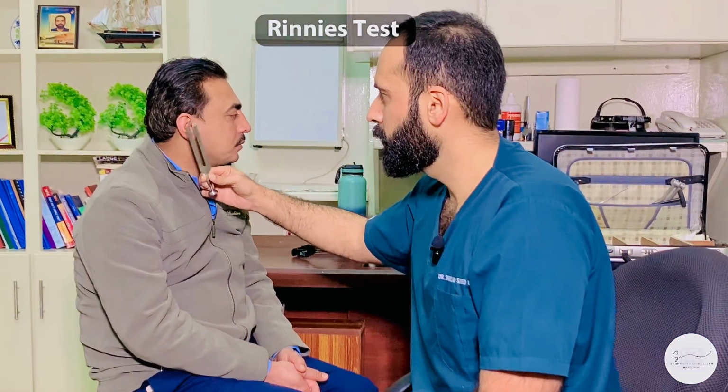So you take the tuning fork, you hold it by the stem, and you will strike it at the junction of upper 1/3 and lower 2/3, and it should be on a padded surface. So the one that I usually use is my elbow. Once you strike it, first you have to listen to it yourself to see whether there are any vibrations that are produced. And the way that you hold it is always parallel to the external canal. It should never be perpendicular.